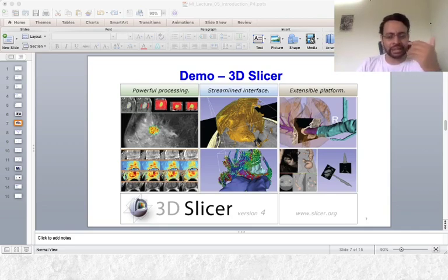MedInria, it has a set of tools, a lot of small tools are there, where for example you could do a nice way of registration. It can do the fusion of images. You could overlay one image on the other, even before and after registration with different opacities, and you could see it nicely. So this is a GUI based tool, you might find very handy. ITK is more about performing registrations and segmentations and commonly used image processing tasks.